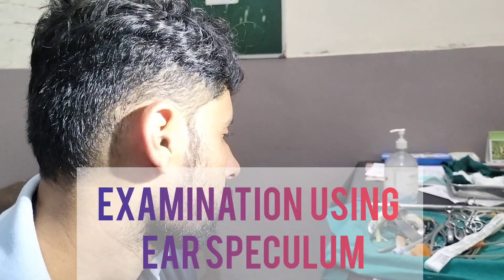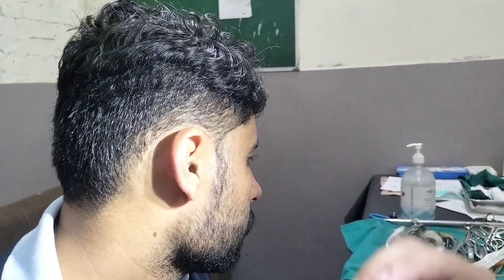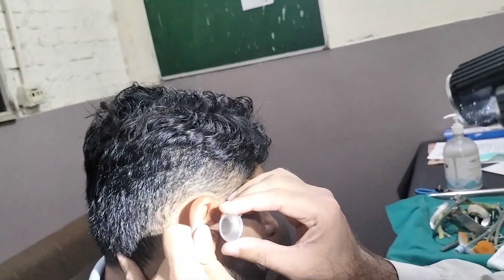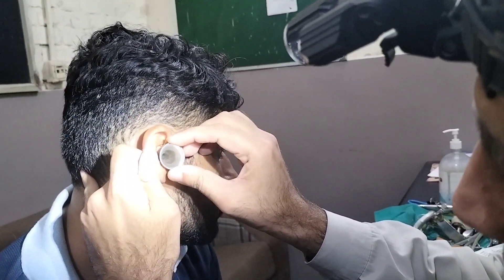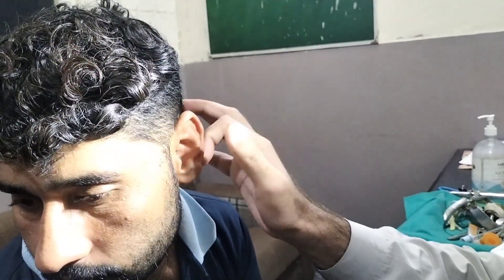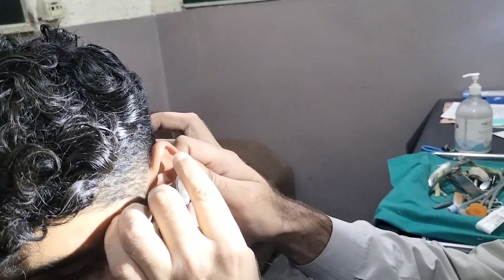Then examine the ear using an ear speculum. Hold the speculum in the right hand when examining the right ear, pull the pinna with the left hand, and insert the speculum in a rotatory movement to examine the external auditory canal — this pushes hair follicles aside and allows proper visualisation of the tympanic membrane. For the left ear, switch hands: hold the pinna with the right hand and insert the speculum with the left hand.